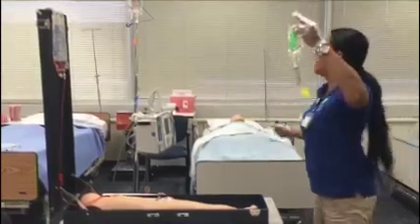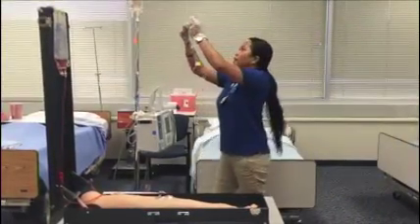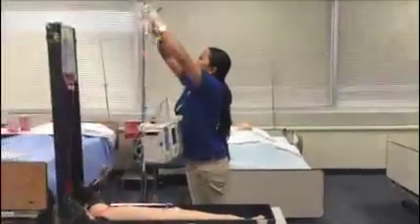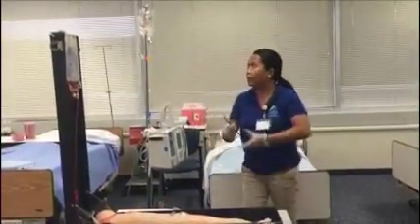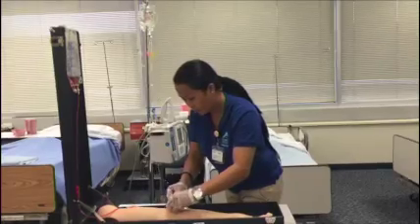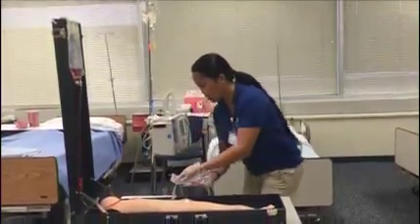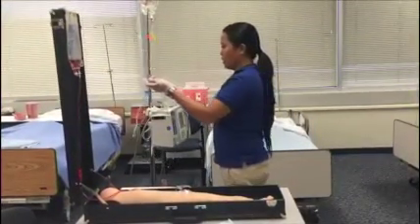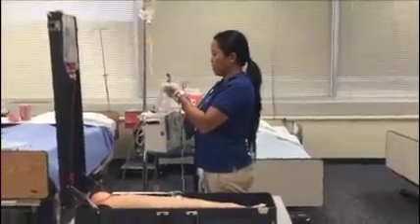This is clamped, and then I will put this up here. Make sure this is not going to be all over the place. That's good. And then I'm going to clamp this. Start from the bottom. Clamp this. Make sure everything's right. Clamping everything.